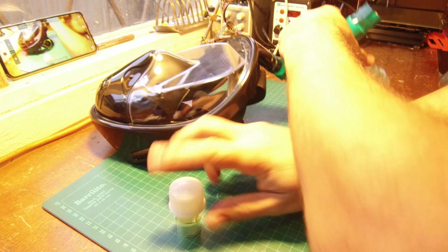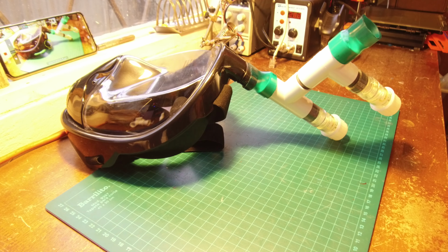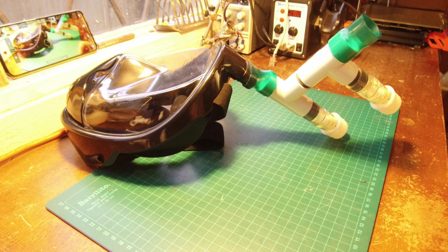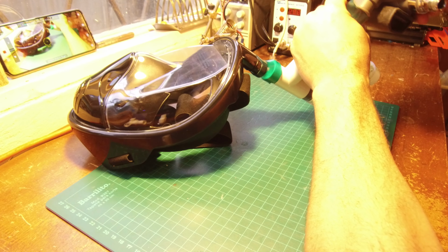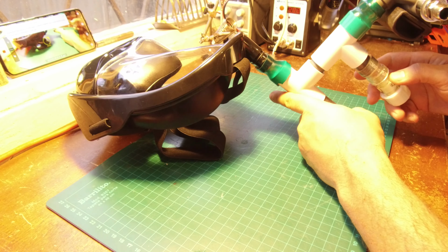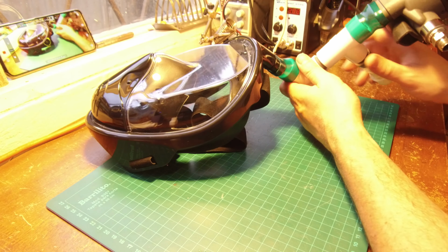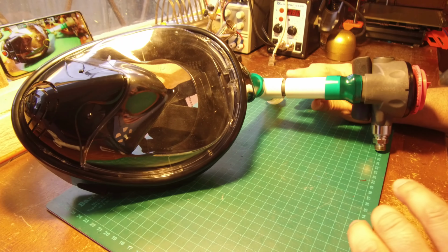Valves are very important. I always put 2, because if there's no pressure relief, your patient's, the user's lungs might explode, because they're going to get all the pressure from the device. If something goes wrong, always put 2 for redundancy. You don't want a pencil getting stuck there or some garbage and having someone's lungs blown. Basically this is how it works.